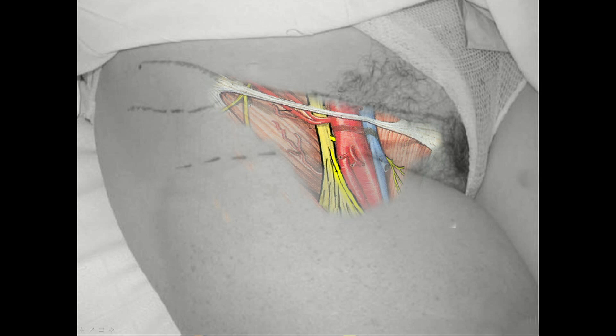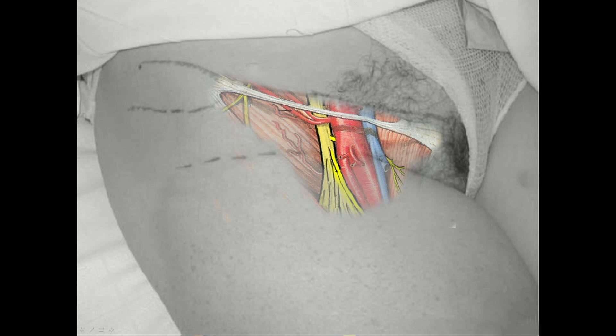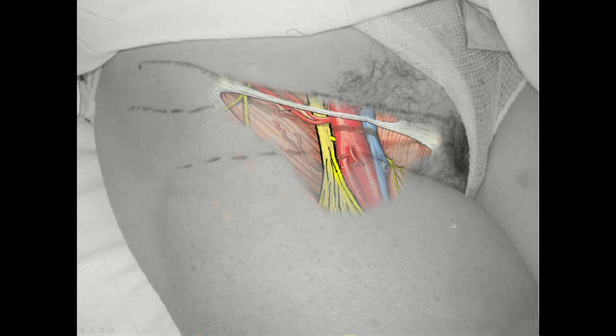The femoral artery is equally a poor marker of the relative position of the femoral nerve. It is notoriously hard to reliably identify with palpation even with experienced hands. Enlarged superficial arterial branches in the region can also be effective pretenders of the femoral artery.